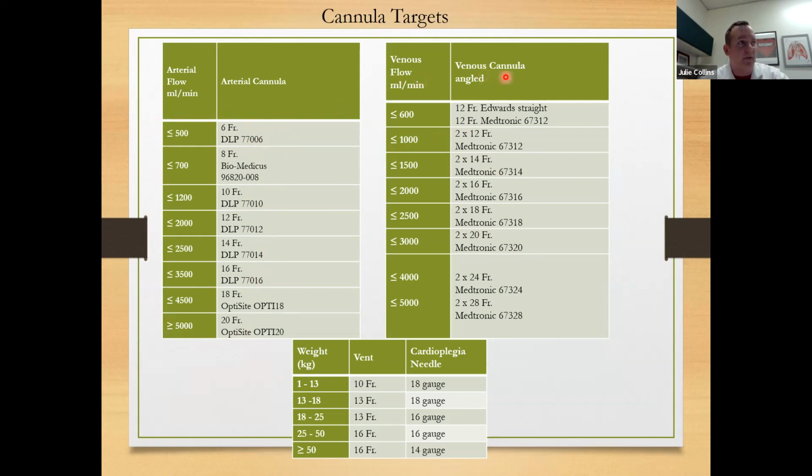And that's how we would pick our venous cannulas as well. There's a pressure drop across a venous cannula. It's a negative pressure drop, but ultimately size dictates what we can throw in. I would say most surgeons want to throw in the largest cannula they can get away with, but ultimately anatomy is going to dictate what they use. Sometimes, due to the anatomy, they're forced to throw in a smaller cannula that can compromise things. But optimally, if they can throw one in and it doesn't compromise anything anatomically, they're going to use it. They try to throw in the biggest cannula that they can get in.